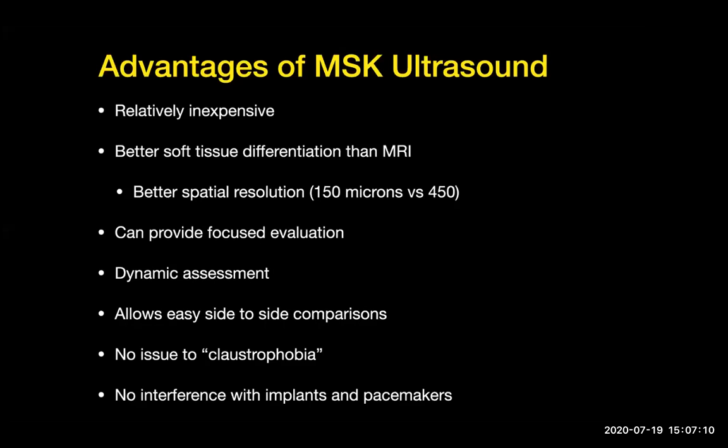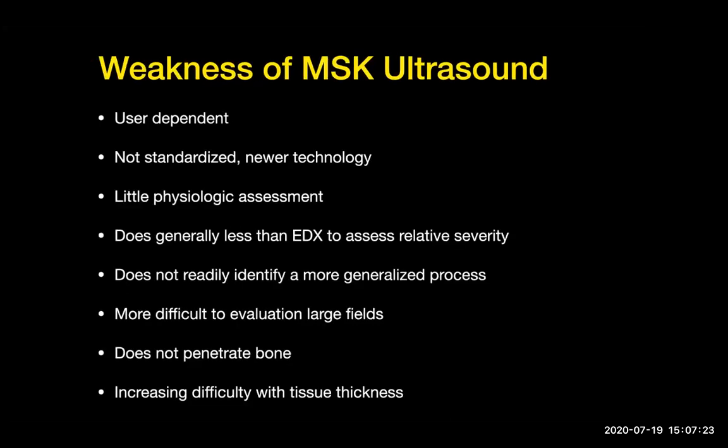No issue with claustrophobia, as we experience in MRI. So you can always do it anywhere. It's portable, with no interference with implants and pacemakers. So it's very, very safe. Well, the weakness of MSK ultrasound is that it's user dependent. It is not standardized. It's a newer technology. There is very little physiologic assessment, if any. And it is also generally less able than electrodiagnosis to assess relative severity.